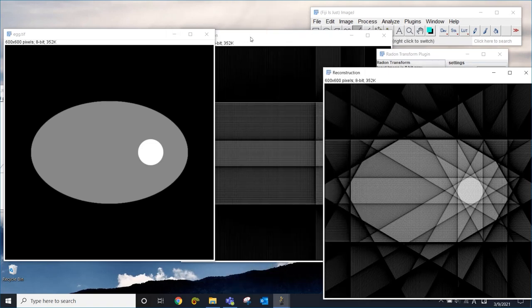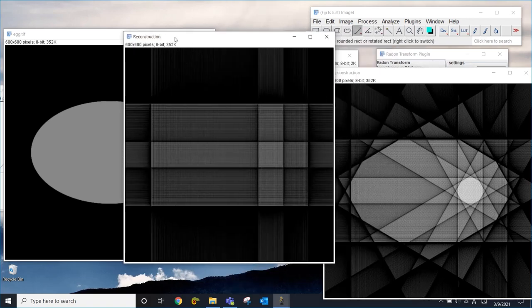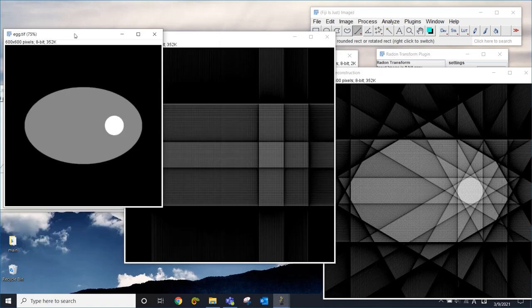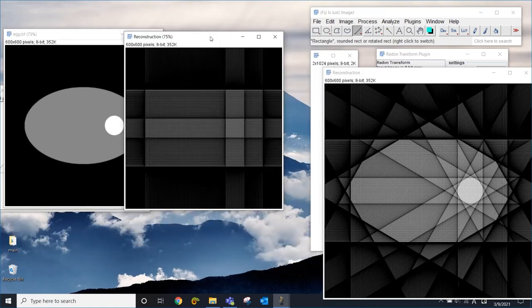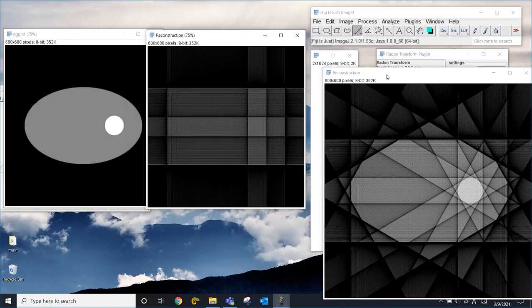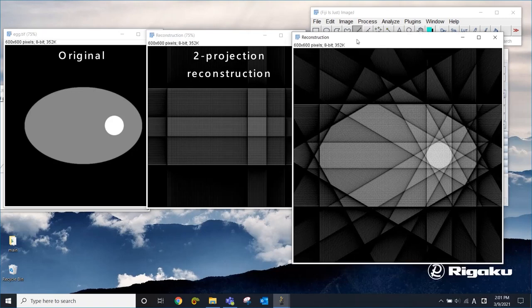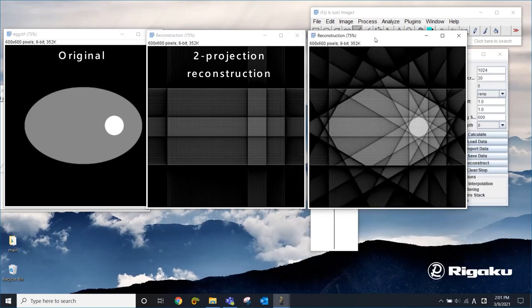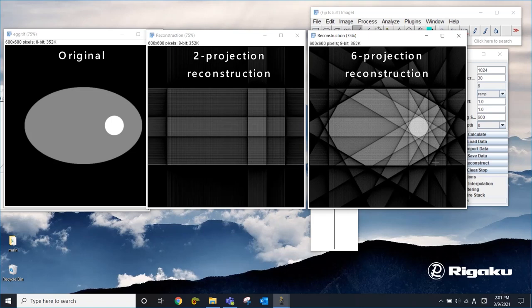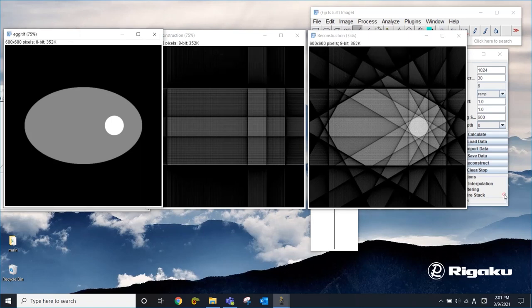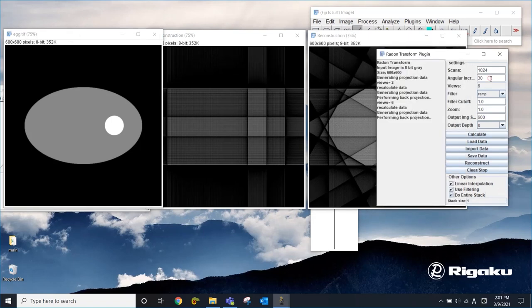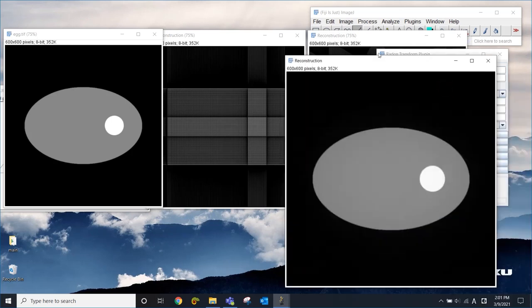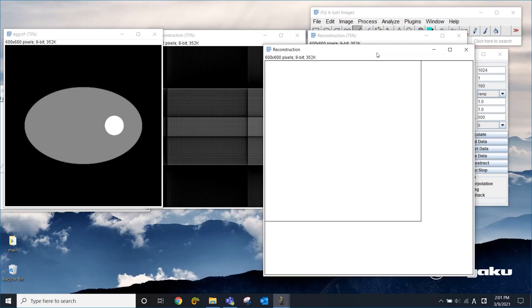So let me make this smaller so that we can do a better comparison. So those are two projections. And this one is six projections. You can see that when you have six projections, the reconstructed image is getting a lot closer to the original image. Now I'm going to jump all the way to the original setting, one degree. Now we're going to create 180 projections like this. And if we use all of them to reconstruct the original image, now we get this.